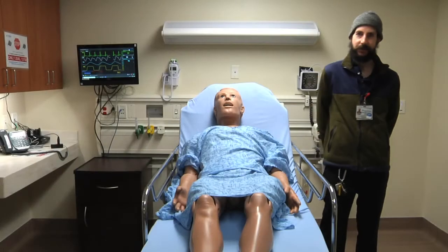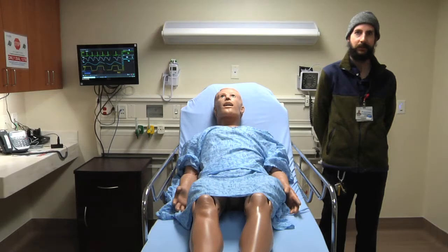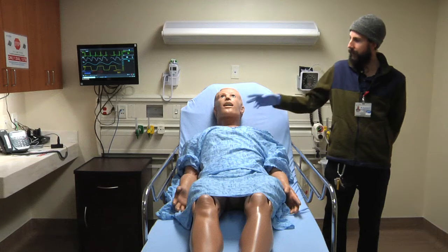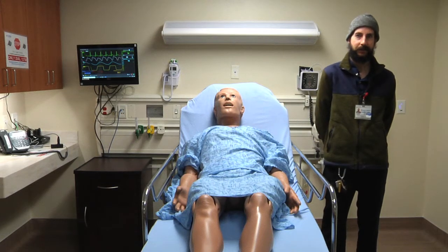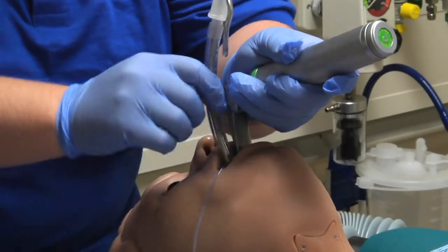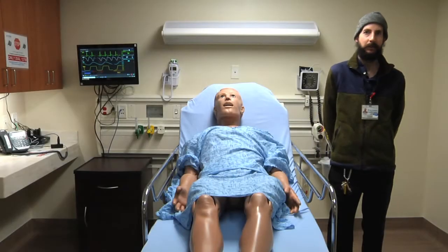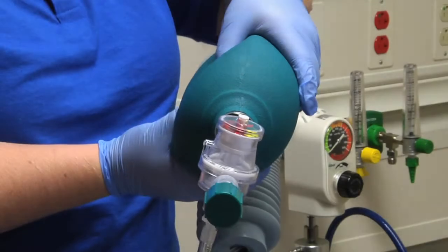So HAL has chest rise and fall. He can be breathing slow, he can be breathing fast, or in an emergency situation, not breathing at all. So HAL can also be intubated, as he has an anatomically correct airway. So if you are intubated correctly, you will see bilateral chest rise.